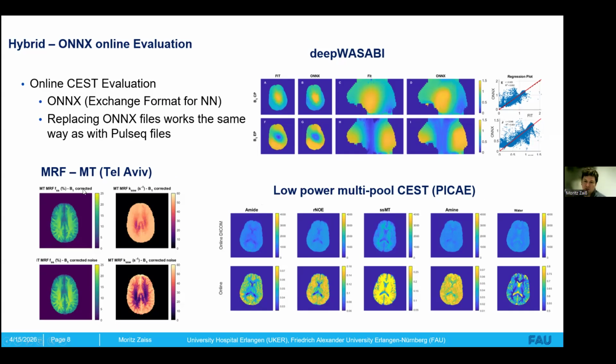multi-Pulseq-CEST. So here you see exactly how you get it from the scanner. So at the scanner, of course, there's a conversion factor. We have to push it to the DICOM integers between 0 and 4000-something. And then you get these maps out. And of course, offline, you get the exact correct ratios, but you can also convert them then to these images. So that's what you get in the scanner.